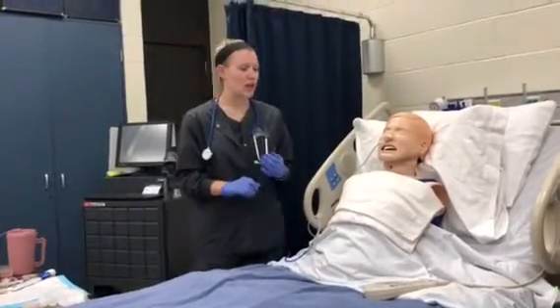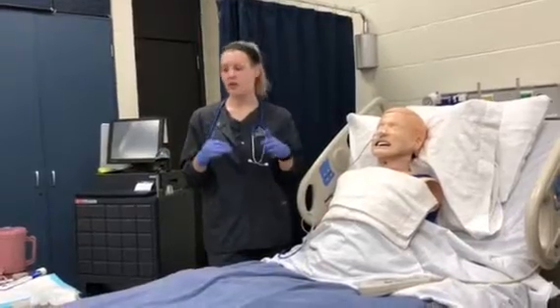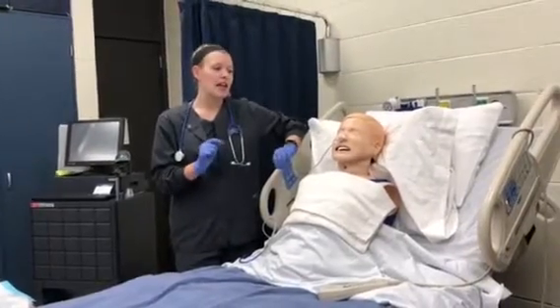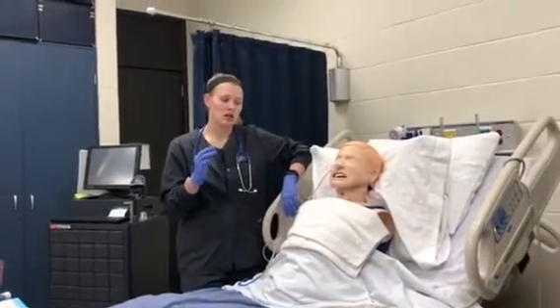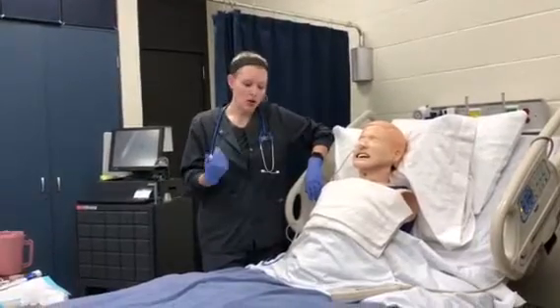If we are giving them food through tube feeding, we would make sure the residual was fine and wasn't too much. After we give the meds, we don't want to do suction for 20 to 30 minutes because we don't want to suck back out those pills that we just put in.